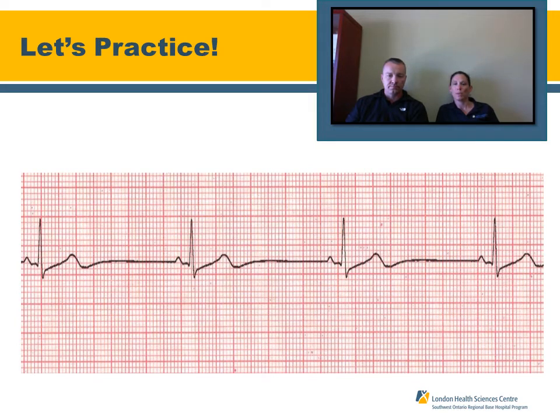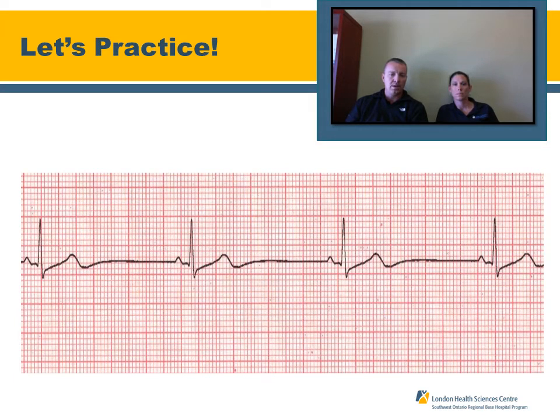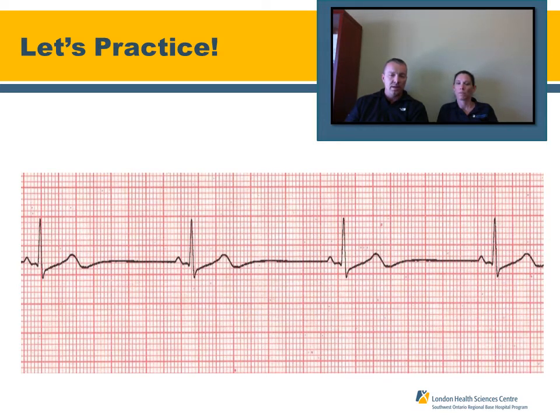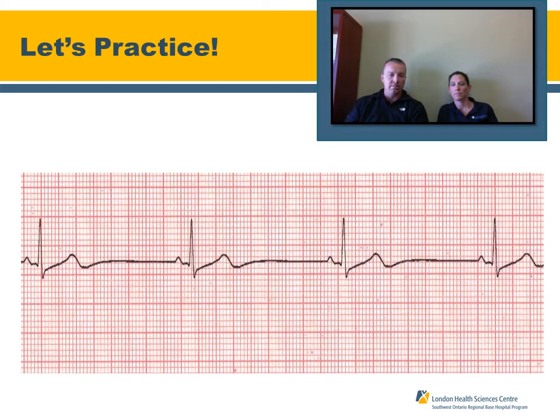Let's do some practice. Looking at the first strip: the rhythm appears regular. On a six-second strip, multiplying by 10 gives a heart rate of approximately 40. There is a P wave before every QRS and a QRS after every P. The QRS complexes are upright, narrow, and regular. The PR interval is less than 200 milliseconds, or five small squares. You can also use the scaling method counting down 300, 150, 100, 75, 60, 50 to find where the next R wave maps out. Most people also check the pulse against the monitor. This rhythm is sinus bradycardia.